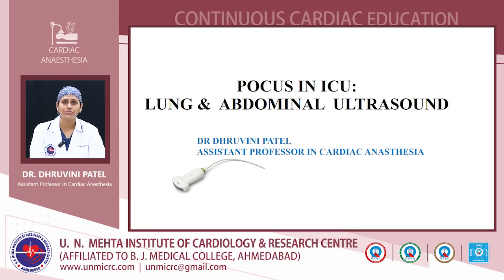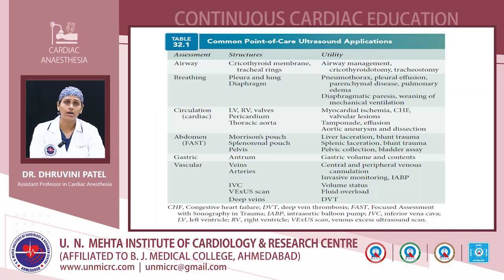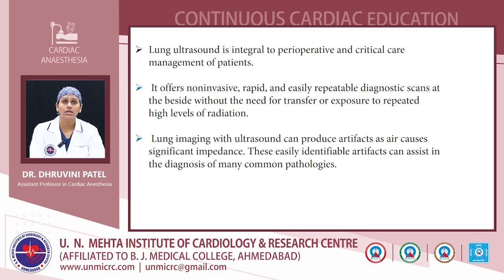As a part of continuous cardiac education, today I am presenting a topic on point of care ultrasound in ICU, lung and abdominal ultrasounds. There are common point of care ultrasound applications for assessment of airway, breathing, circulation, abdomen, gastric and vascular. But today we focus on point of care ultrasound mainly for lung and abdomen.